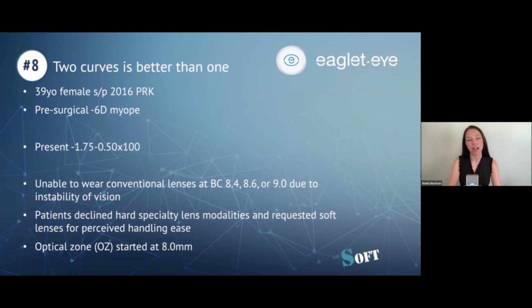That means that the height of the lens may be inappropriately matched, the diameter perhaps too big or too small for an eye shape, and then of course base curve we look at as well. It's an area that has been increasing in interest. In fact, the improvements that we've seen in understanding comprehensive ocular shape have allowed us to become interested again in custom soft design related to ocular shape.